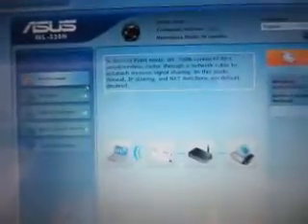Okay, I've already chosen the access point working mode, and now we are going to give a name to this wireless router, and later you can use your mobile phone to capture the signals. So I'll name this SSID as Edan.